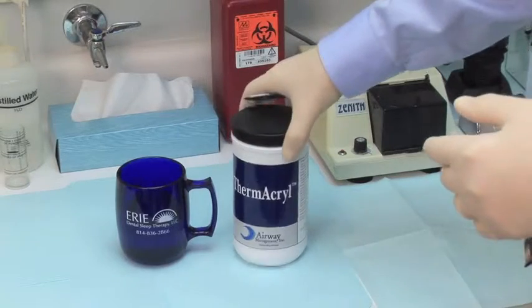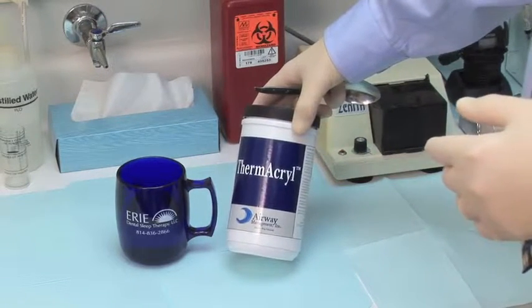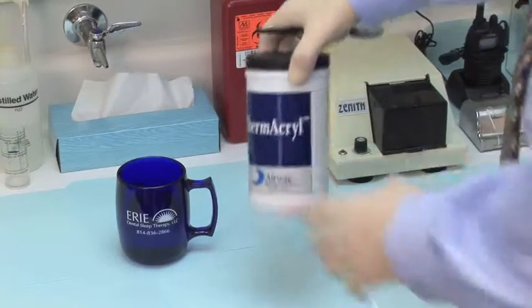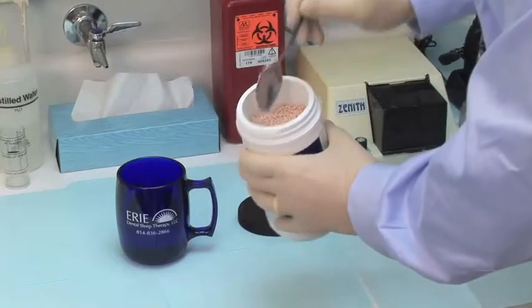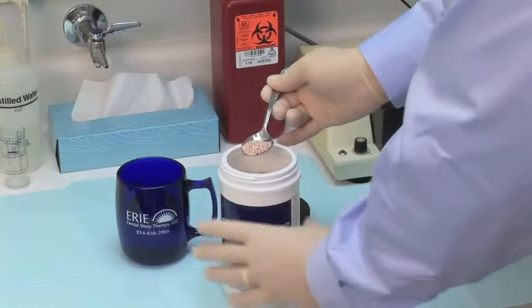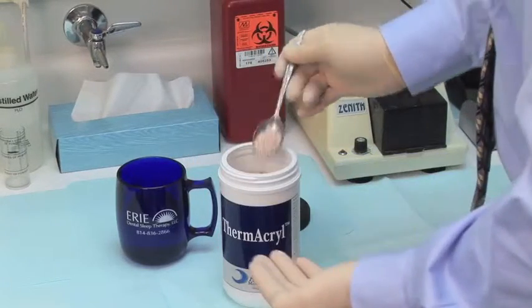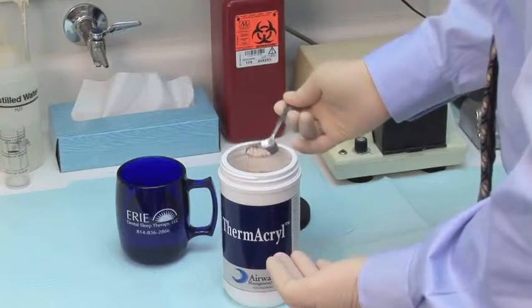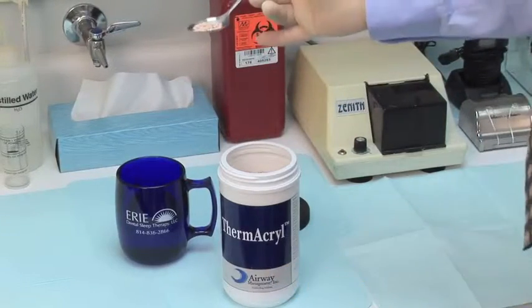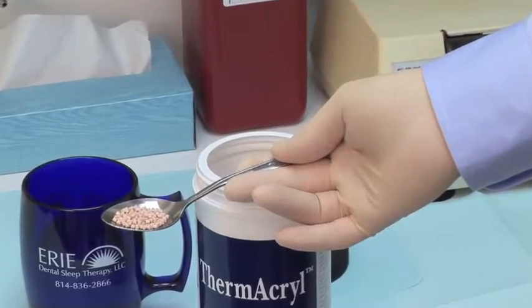We're going to be using a material called Thermacryl, made by Airway Management Incorporated. It's a thermoplastic material. It comes in these little beads that you can see here, and you only need approximately half a teaspoon of this material.